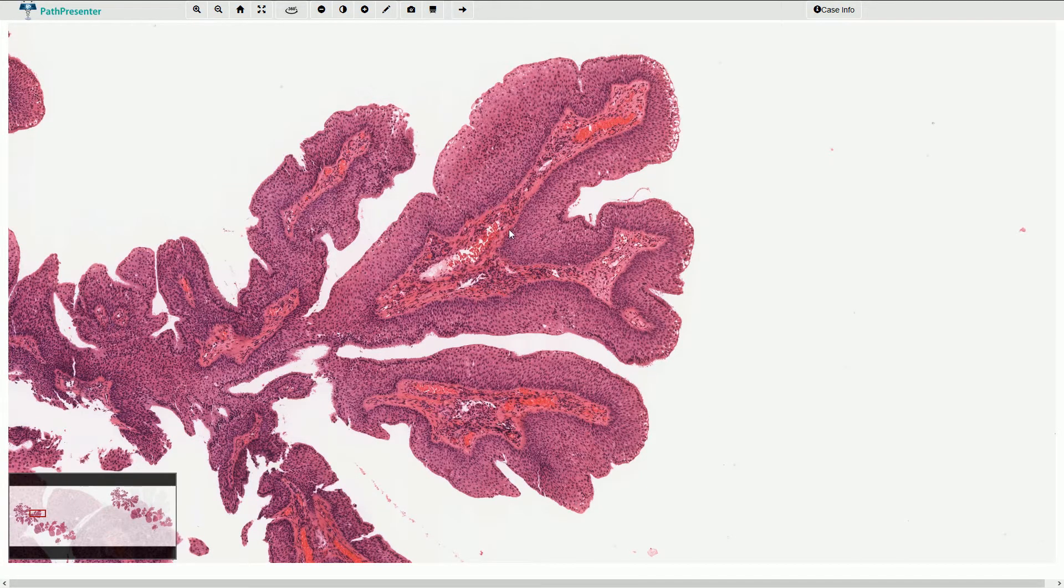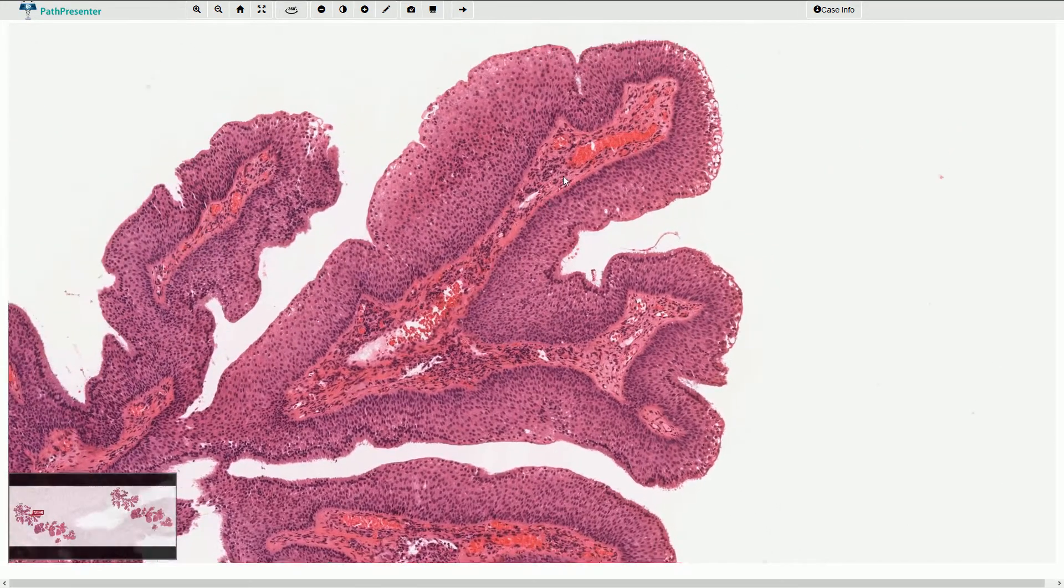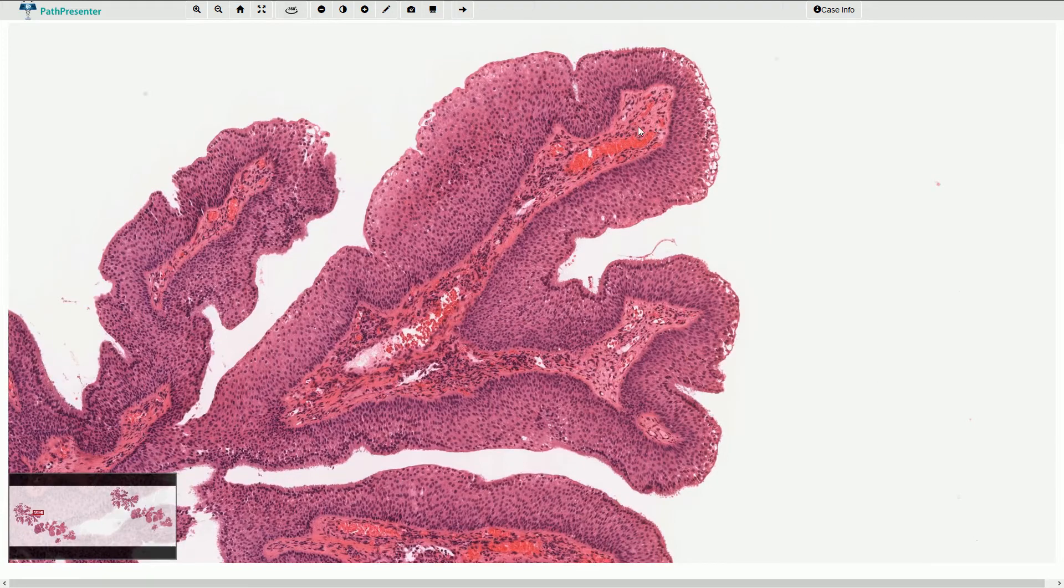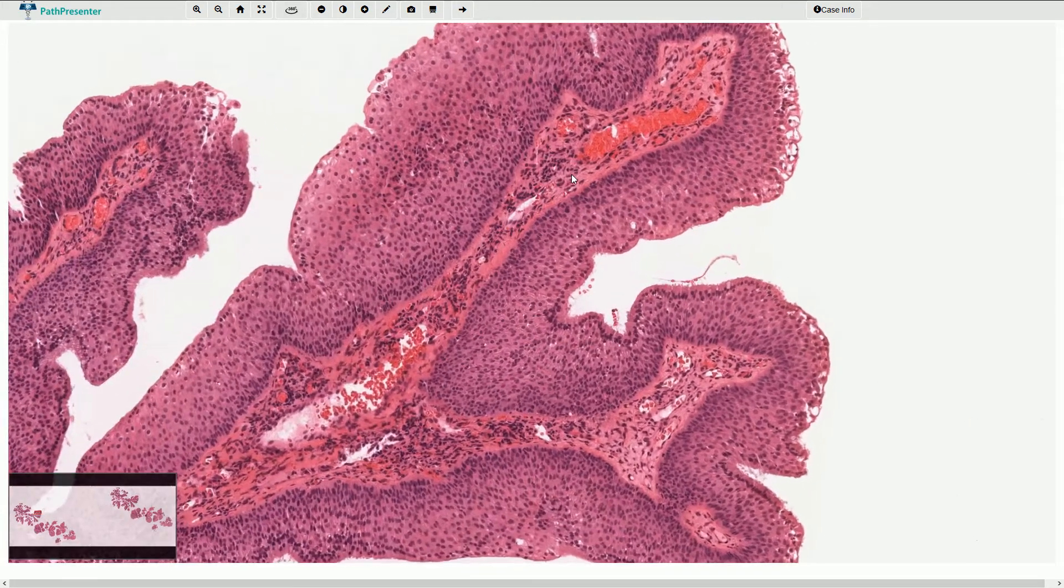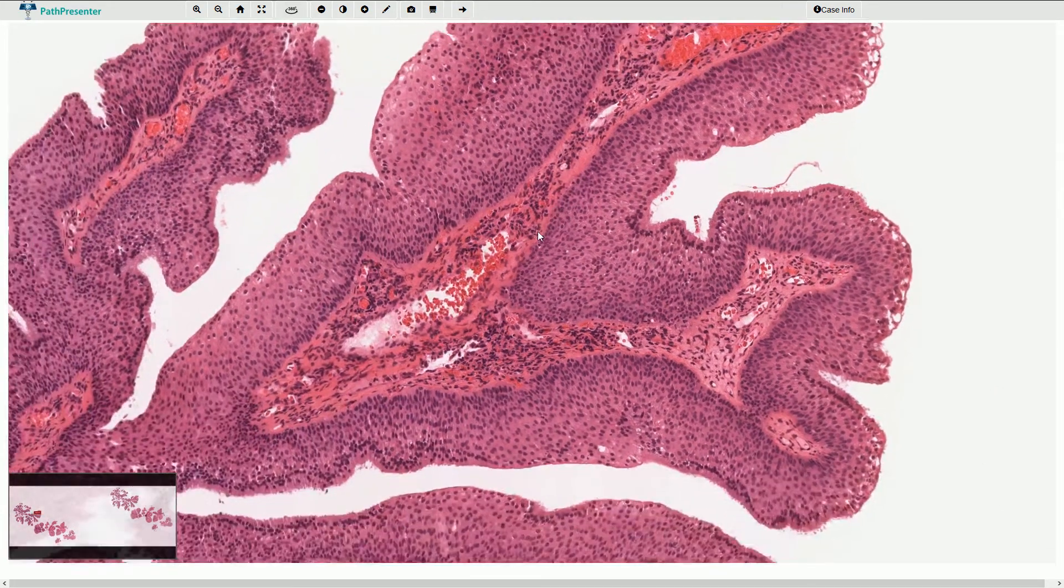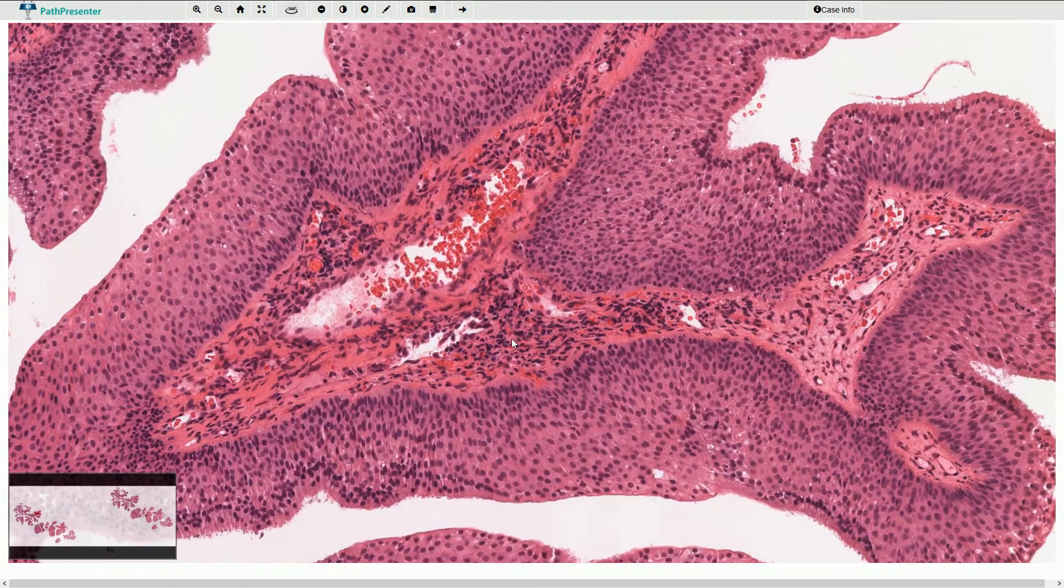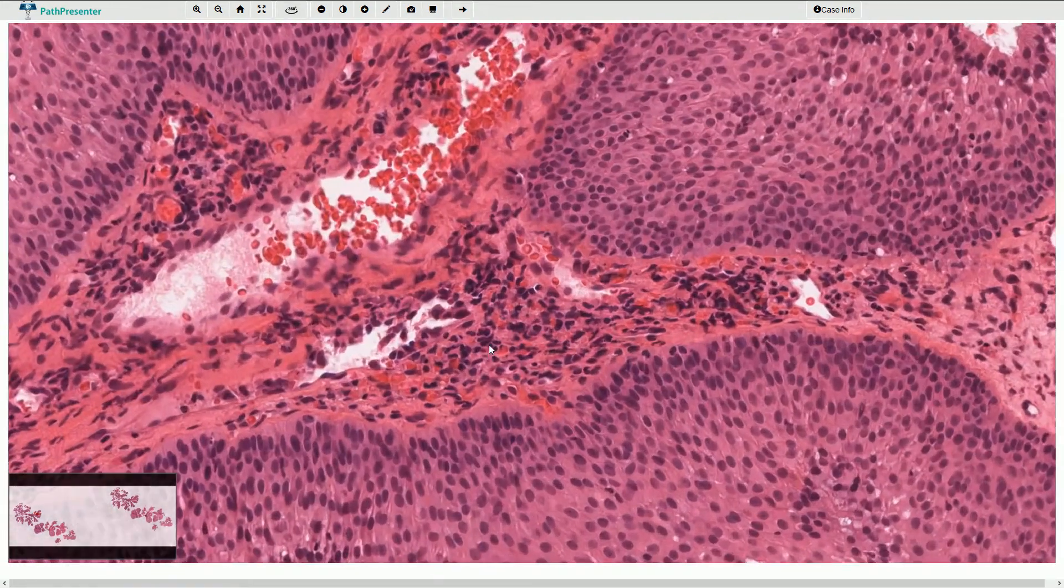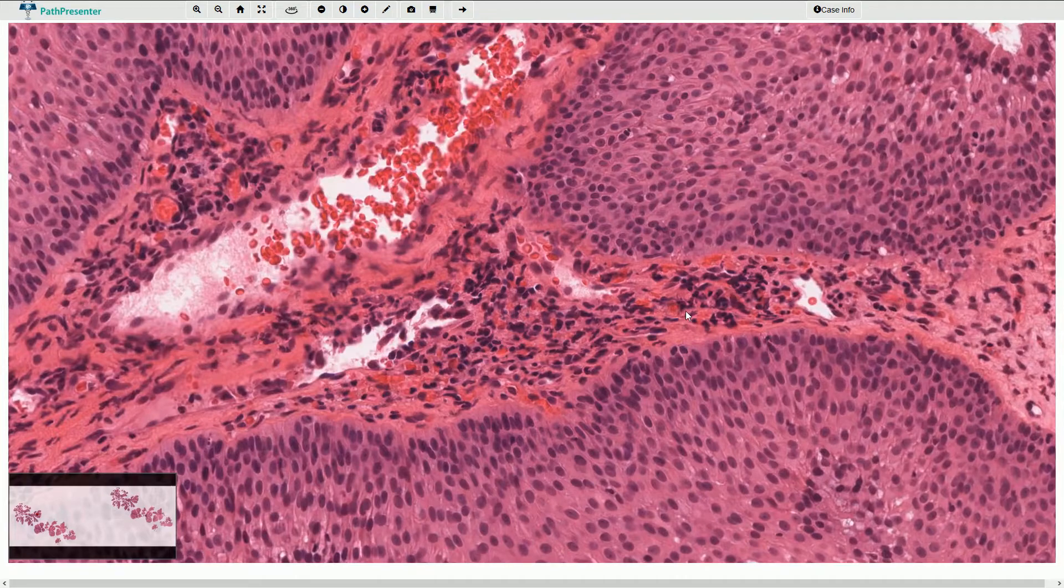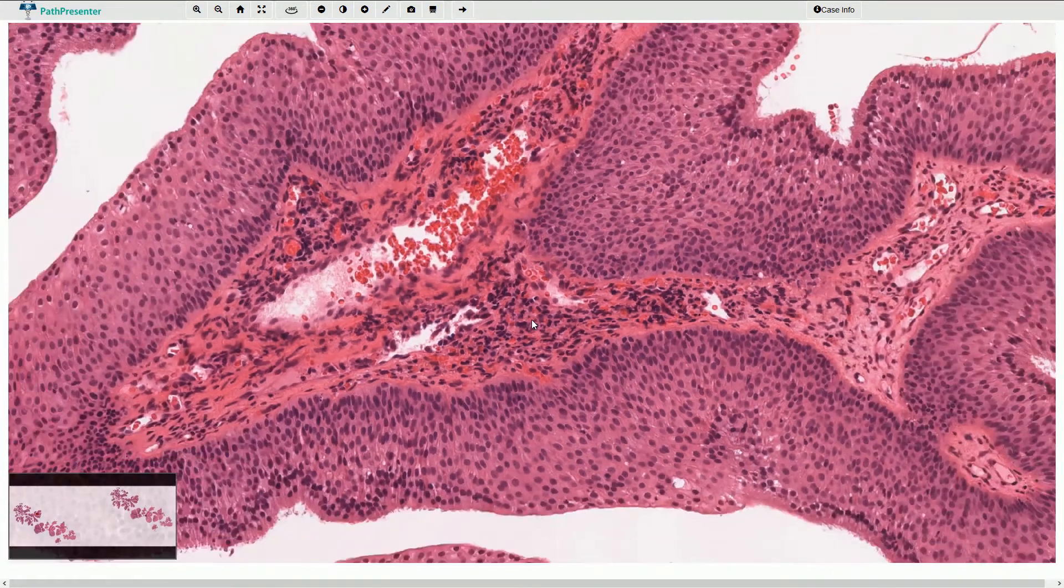The fibrovascular cores consist of thin-walled capillaries that are slightly hyperemic. We have fibrous tissue and sometimes some inflammatory cells, including plasma cells and lymphocytes mainly.